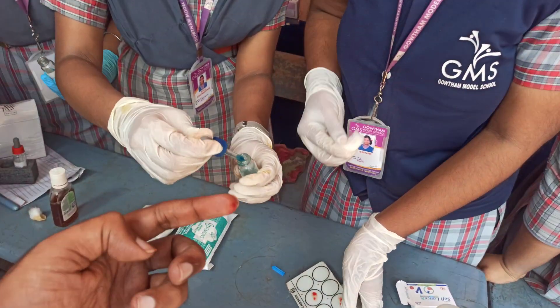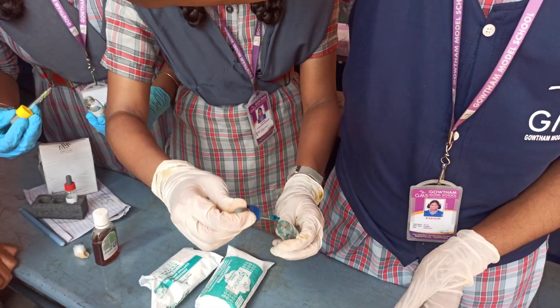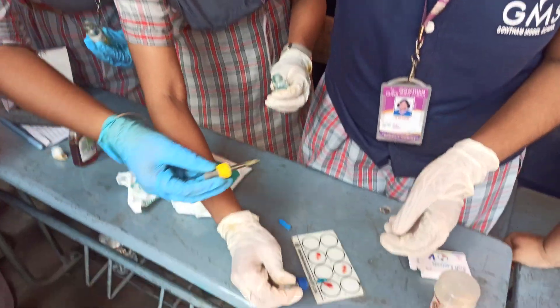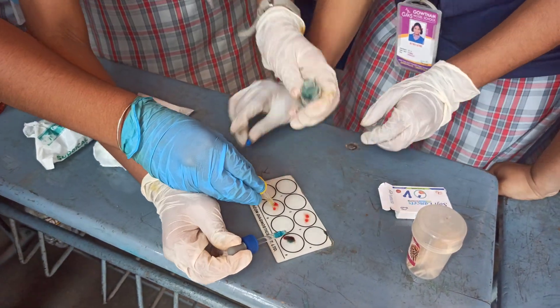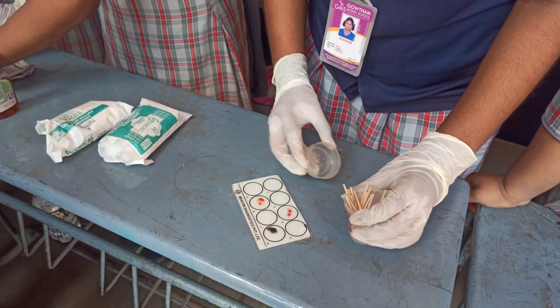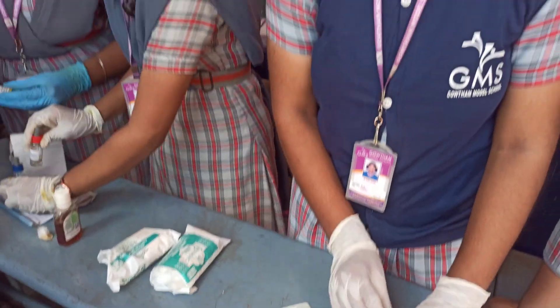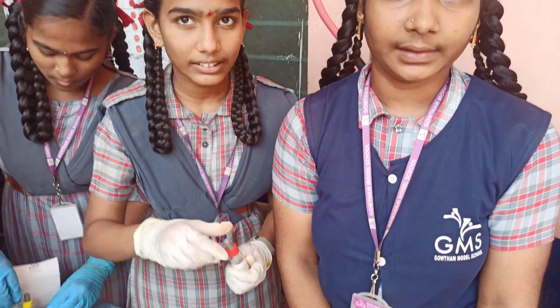These are the serums used to test the blood group. What are the serums' names? Anti-A, Anti-B, and Anti-D.